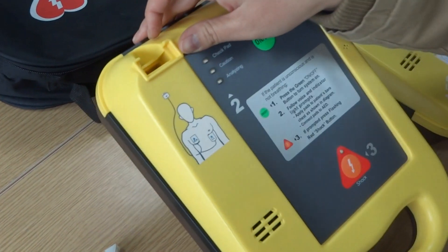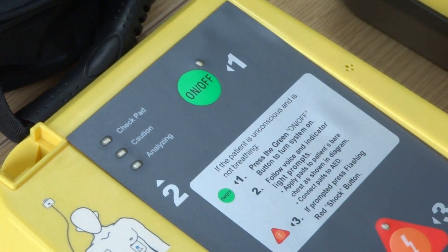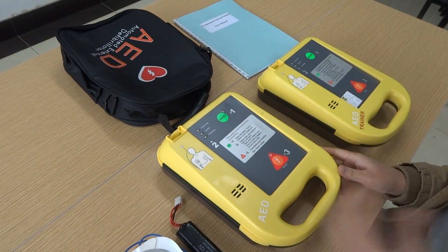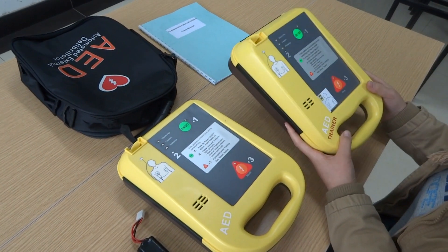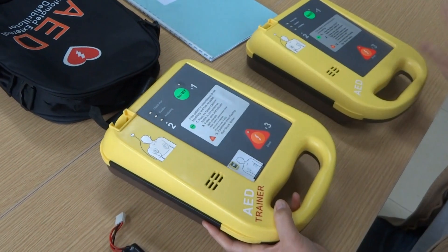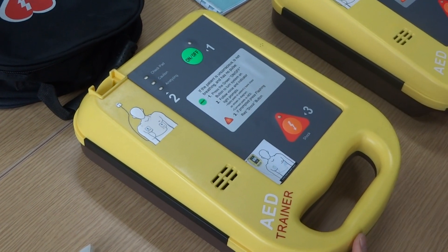This is the connector for the electrode pads. This is our real device, but because we cannot operate it — it must be used in a real situation — we will show the operation through this AED trainer. The AED trainer will have the same operating process compared with the real device.